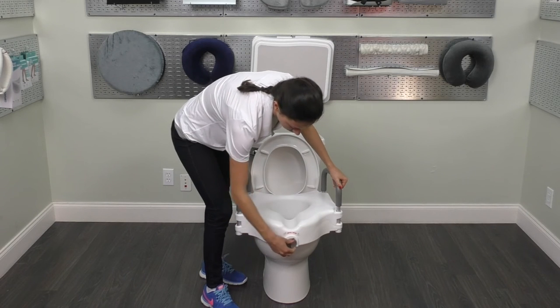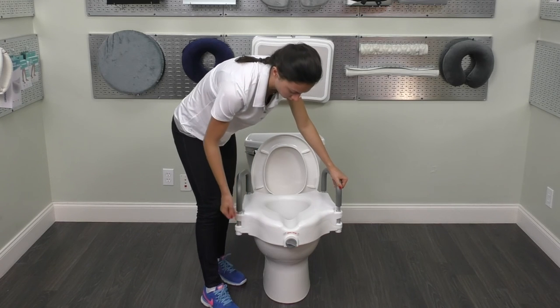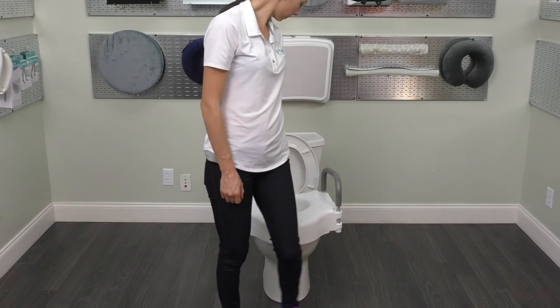Turn adjusting knob clockwise to tighten the product securely in place. Hand tighten only — use no tools and be careful not to over-tighten, as threads on the adjustment bracket may strip. Check for secure fit routinely before using the product.